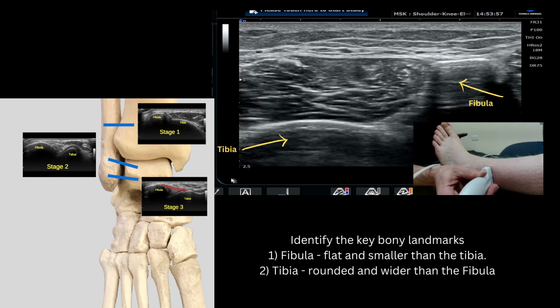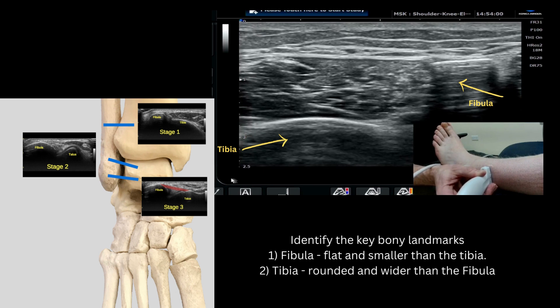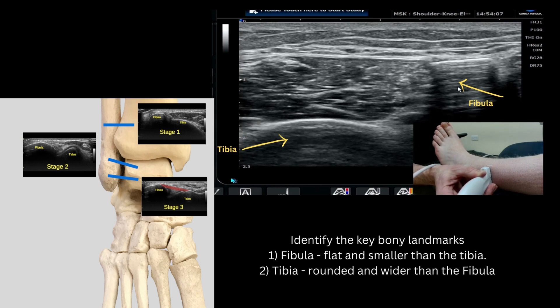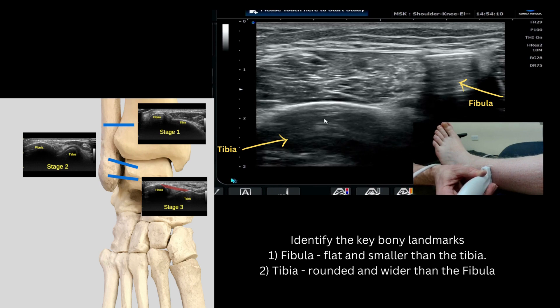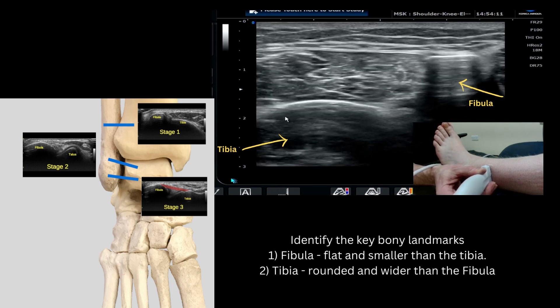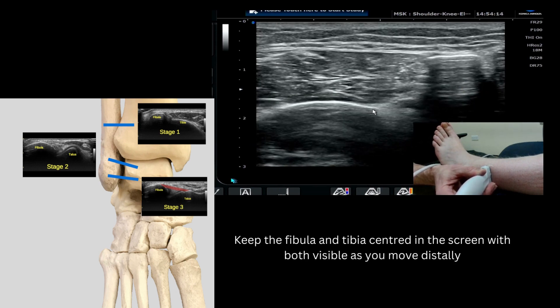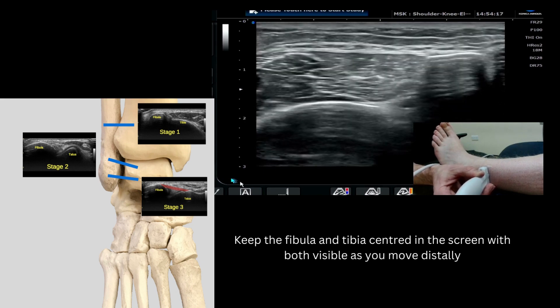As we look at the live scan image, you'll see two very distinct hyperechoic bony landmarks. Laterally you have the fibula, which has a very flat appearance and is much smaller than the more medially placed tibia, which is much wider and has a very curved appearance on its superior margin.